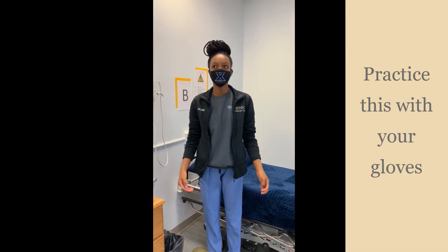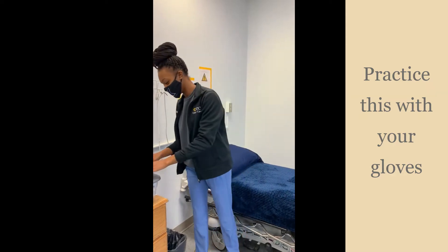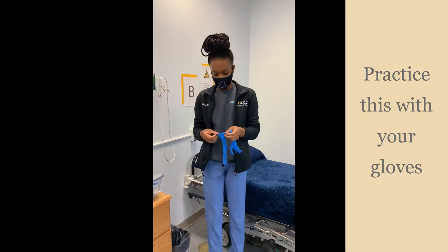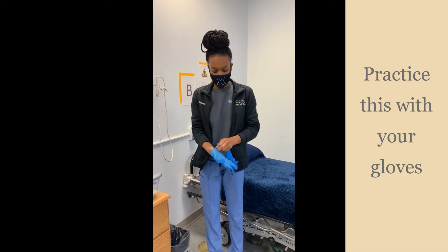Gloves are one of the most used items in healthcare to help protect you from bodily fluids. You want to make sure that the gloves are fitted to your size, and when you're putting the gloves on, make sure that they come up throughout your wrist.